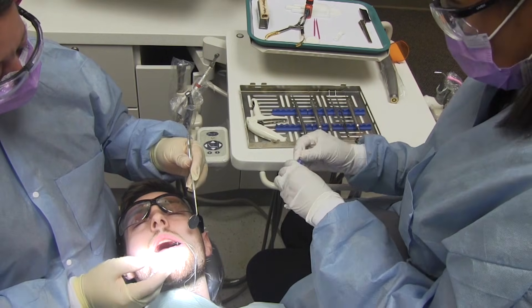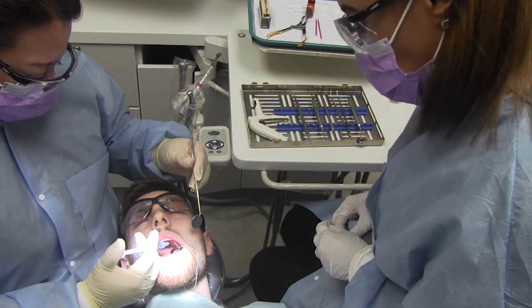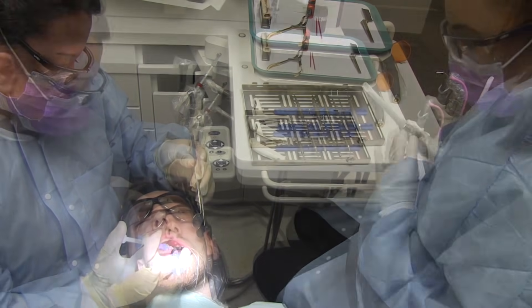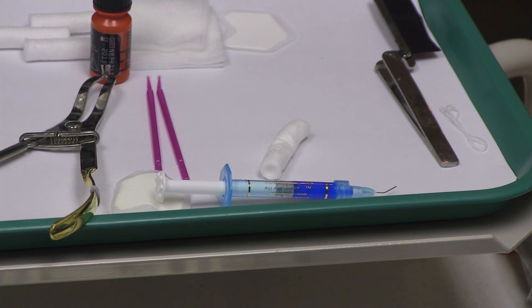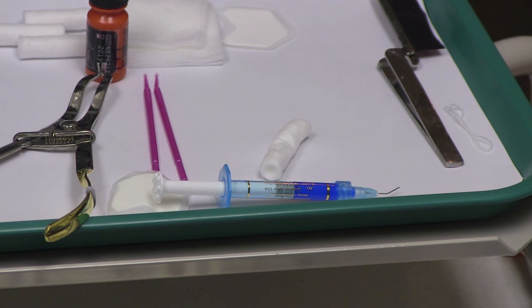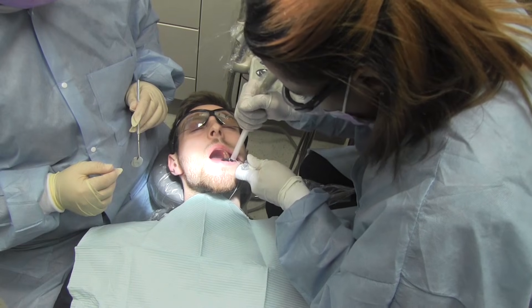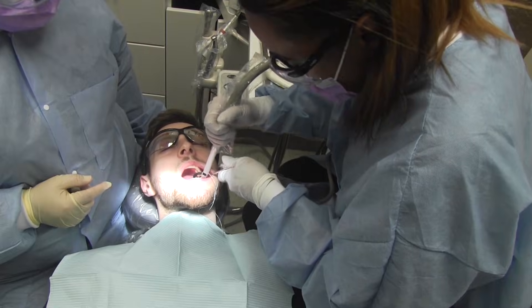Next, pass the acid etch to the dentist with the tip positioned so that it will allow for easy application to the tooth. Place the acid etch syringe back on the tray. Follow the manufacturer's guidelines and wait the recommended time for the acid etch to remain on the tooth, then rinse the tooth thoroughly with the air-water syringe. Completely dry the field with air.